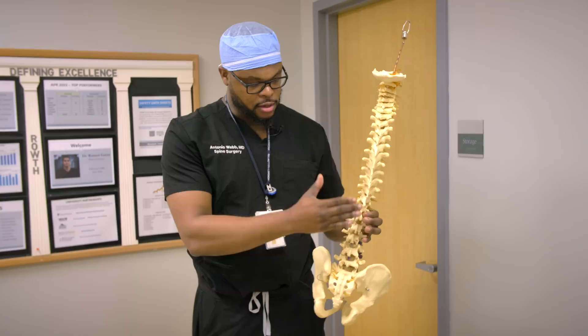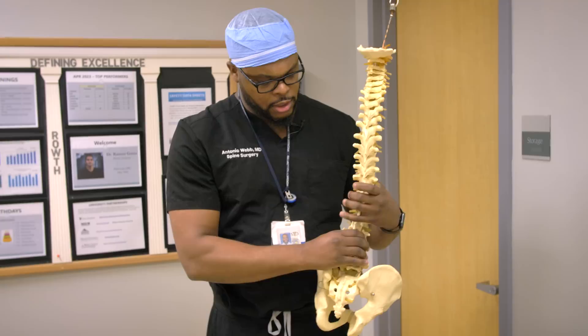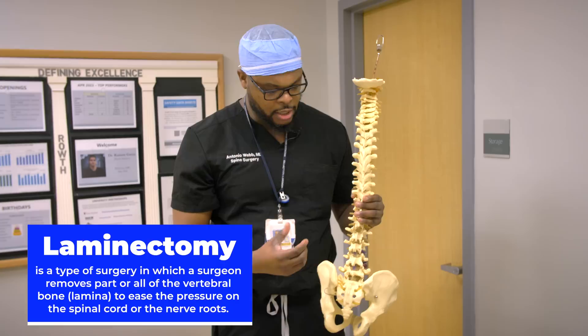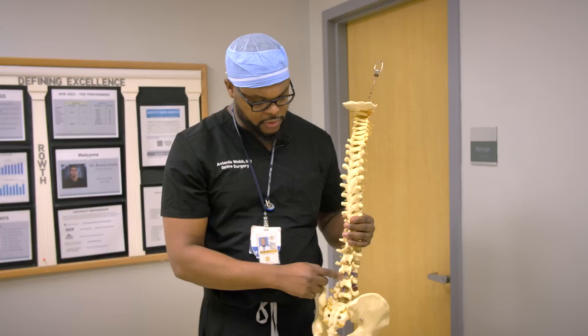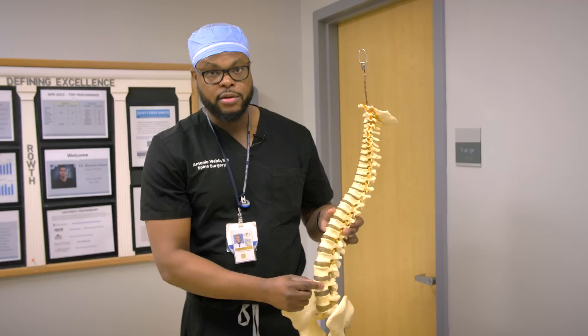This is the posterior back portion of the spine, also called the dorsal side. This is the spinous process at every level — those are the bones you can feel on your back right in the midline. And this is the lamina on both sides. We're doing a laminectomy, which means we remove that lamina that's causing pressure on his spinal canal. Once we have the decompression done, we'll place pedicle screws. These screws go into the bone and into what's called the vertebral body, holding the spine in place so that it fuses together.